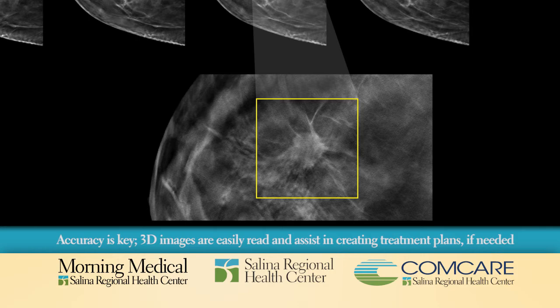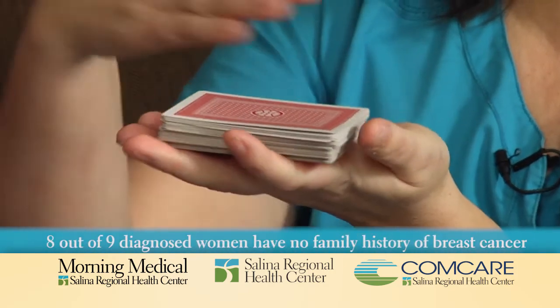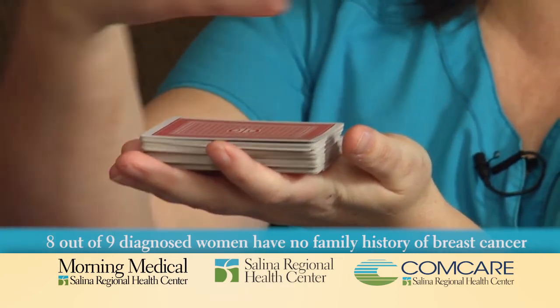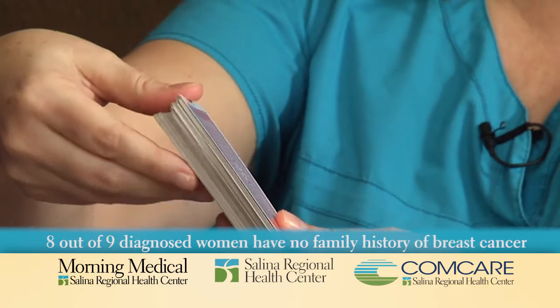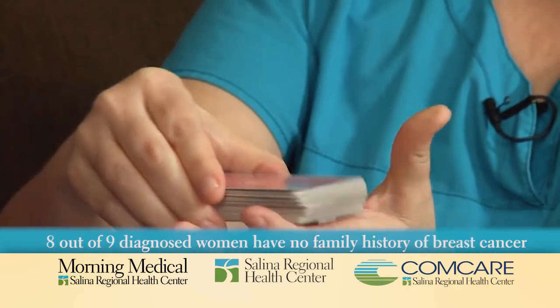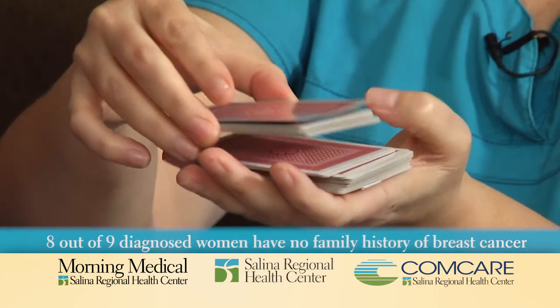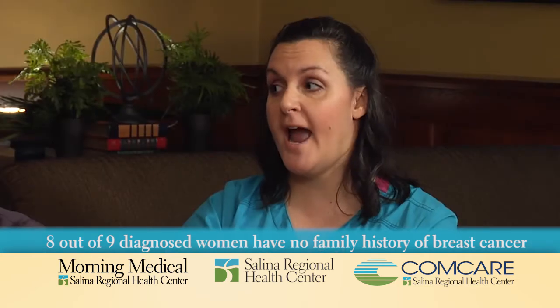in the breast tissue. So visually, if this deck of cards represents your breast, your breast is 3-dimensional. Your mammogram should be as well. So basically, we have all this tissue that we need to get through. So as we take the multiple images, image number 15 itself may not be very clear, but if we go through to image 40, it is. So we are able to see things much more clearly and with greater accuracy.